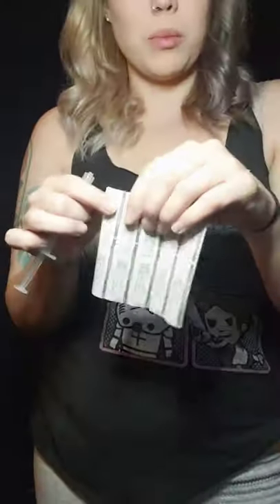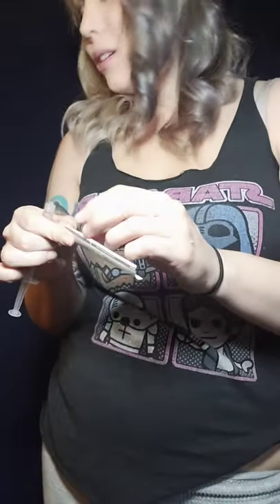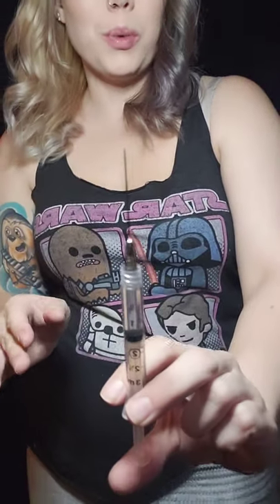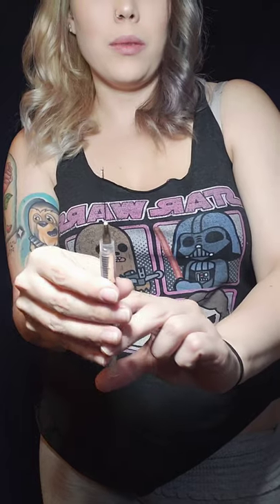Put the used tip in my sharps container, get my smaller needle. My baby's playing with my background sheet — that's hiding my filthy house — but yeah, new needle, much smaller, still huge but smaller. I'm going to push the air out that was in the needle. It's dripping. Go back to the spot that I cleaned.